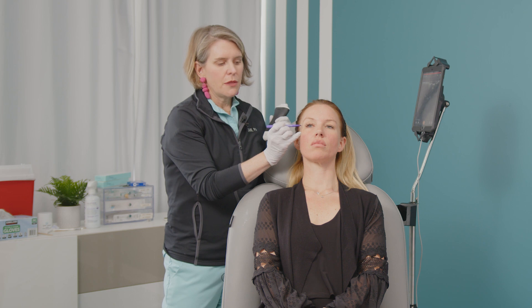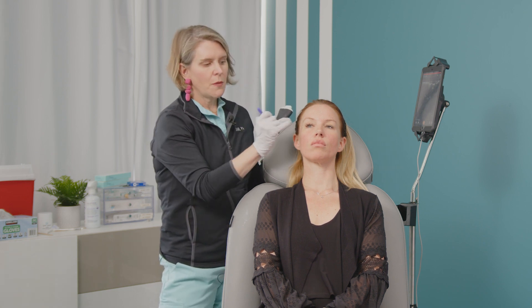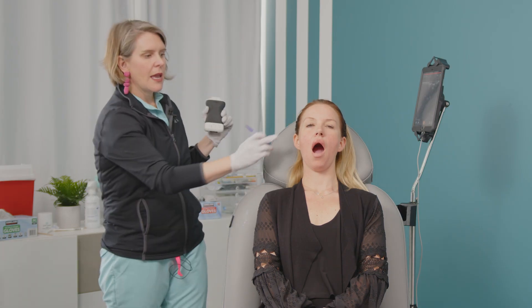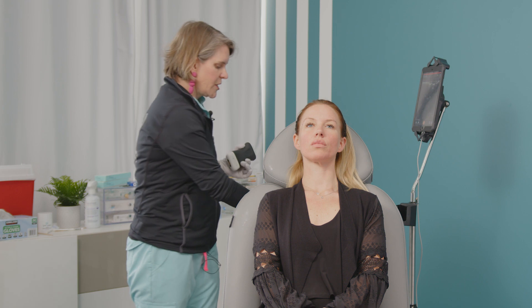We always start with where we want to put the filler. So Nikki, I'm going to have you open your mouth. This is how I find what I call temple pool — this is how I find the bottom of the pool. I find the deepest recess and I put a little dot there to use as a point of reference. You can close your jaw. And that is where I'm going to be focusing my bolus.